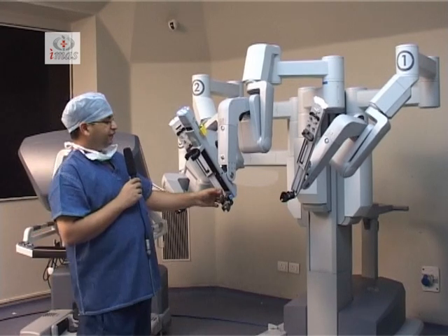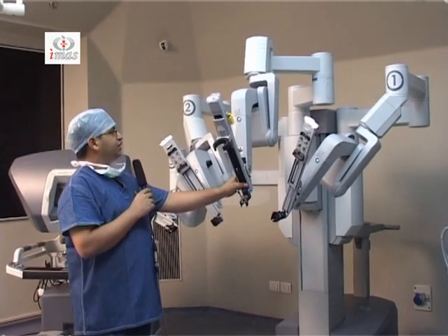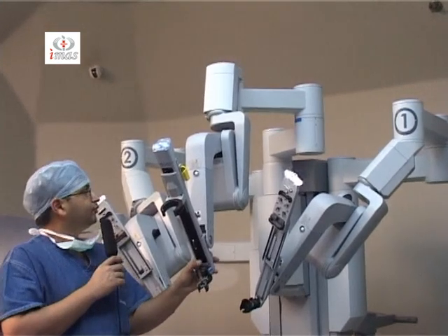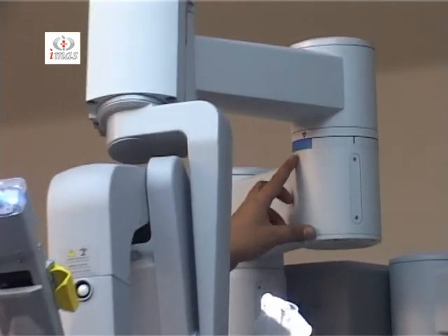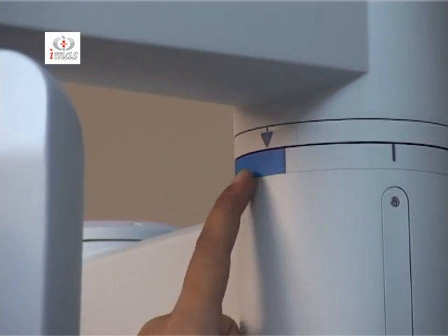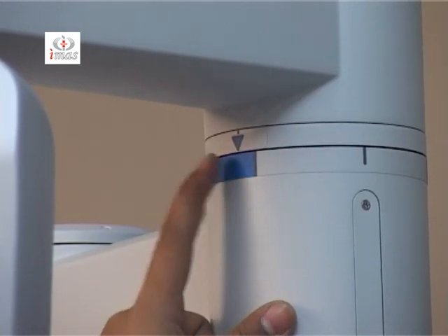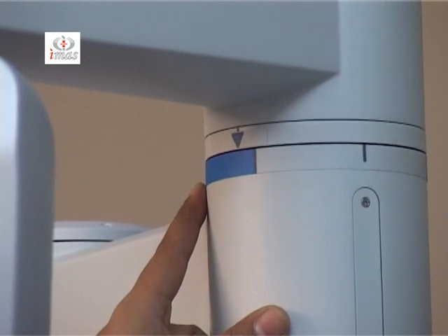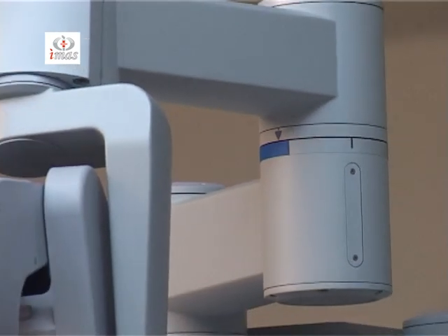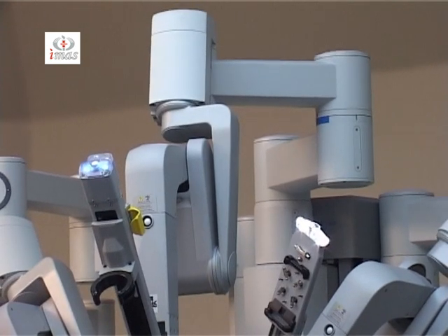So now this is the camera arm, and you will appreciate that there is a thick blue line on the camera arm here. This is the thick blue line, and this contains a blue arrow as well. This is called the sweet spot. The sweet spot has to be in this thick blue band in order to avoid any external arm clashing and for proper movement of the camera. And ideally it should be in the center of the thick blue band like this.